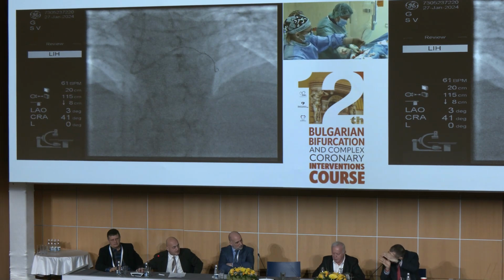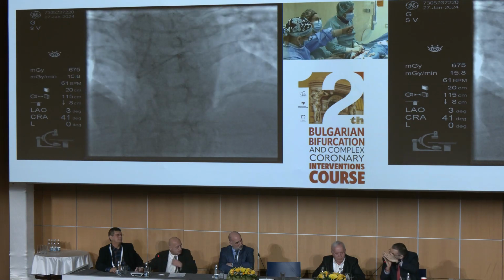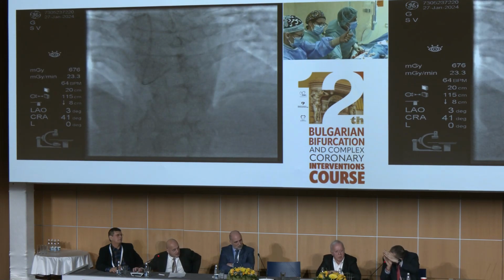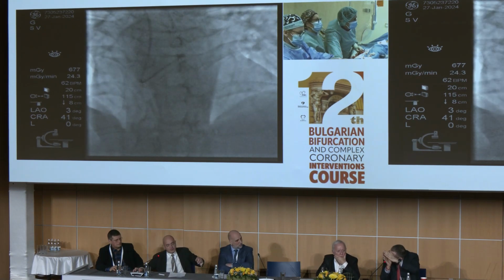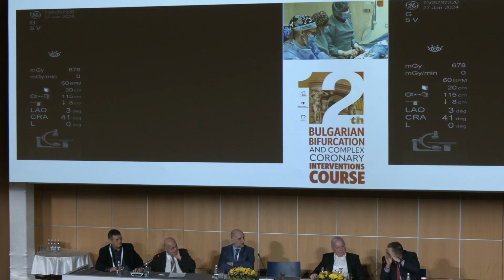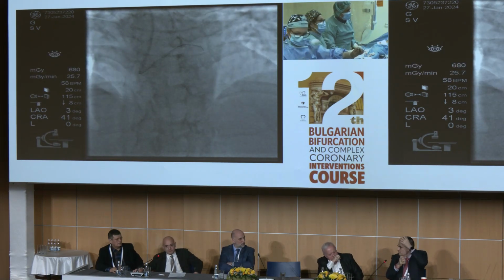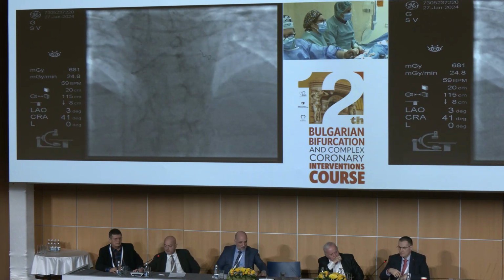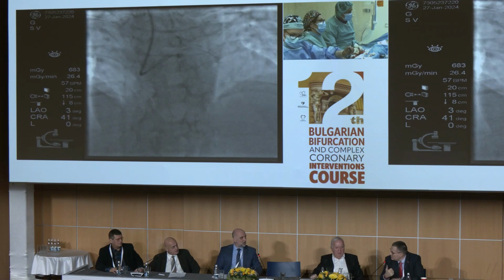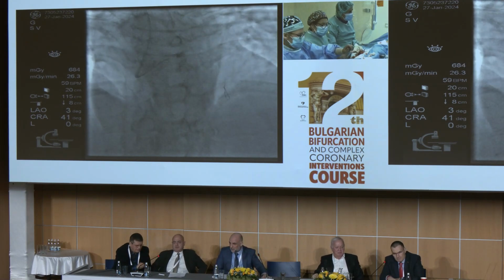And the marker of the pot balloon is at the level of the marker of the side branch balloon, because this is exactly the polygon of confluence, which with angiography is almost impossible to assess exactly. But the balloons are configuring just because these are two cylinders. Good, interesting. And this is enough, one inflation, without kissing. Probably yes.